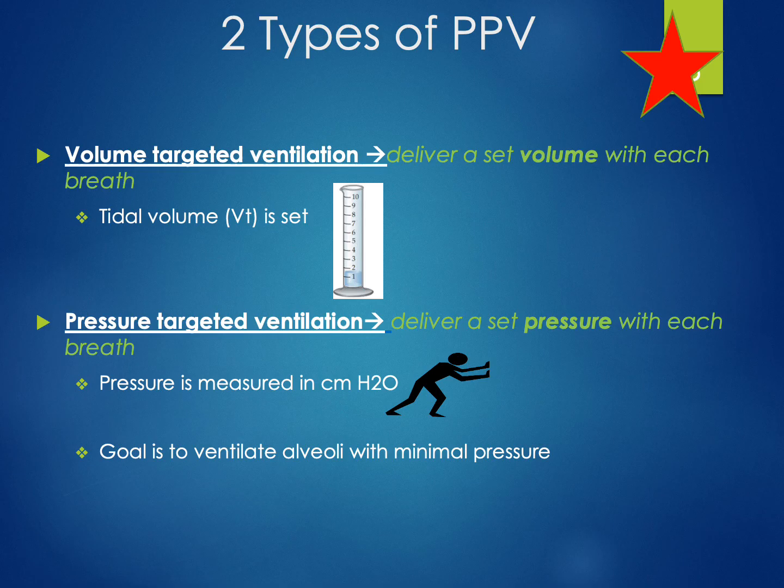And this setting on the ventilator is called pressure support. Therefore, in this case, if we have a patient on a pressure targeted ventilator programmed at 10 centimeters of water pressure support, and it just so happens that the ventilator is going to give your patient 15 breaths a minute, that means 15 times a minute, the ventilator will push that hard, that same force that 10 centimeters of water would produce, that same weight, the same amount of pressure, it will push 15 times a minute to deliver those 15 breaths.